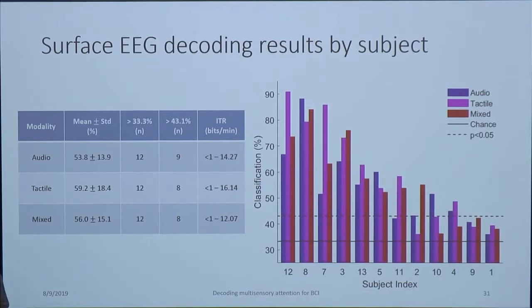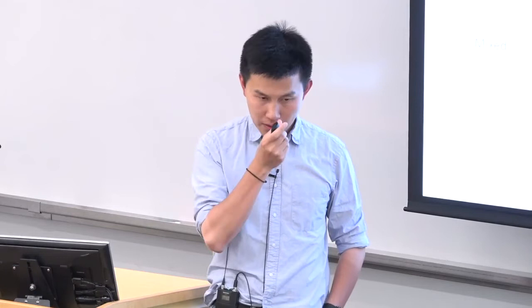Yeah. So for those subjects, have you checked the noise levels or SNR? We can go to what the issue is later, but for the noise level, there's a way to control for the noise by measuring the impedance of the electrodes before we start the whole experiment. So we place gel in until we guarantee that every single sensor is actually working, and the impedance is below 10 kilo ohm. So in that sense, the noise should be comparable. Okay. Yeah.